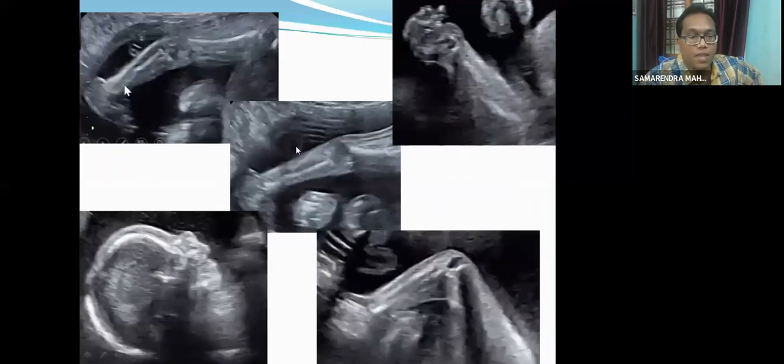On examination, it has been found that the muscles around the bones in both lower limbs showed wasting. It should be somehow convex, but the shape of the muscles around showed wasting. Also in the left upper image, it has shown the heel is unduly prominent. It is a rocker bottom foot position.